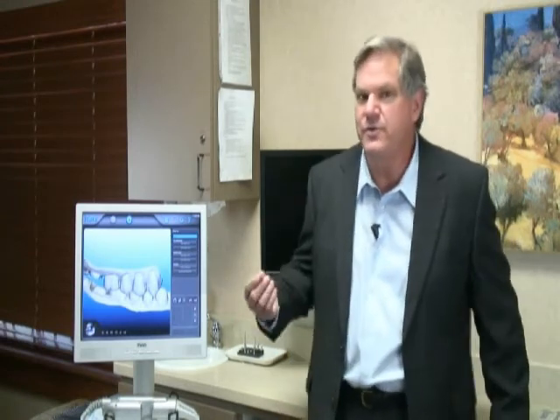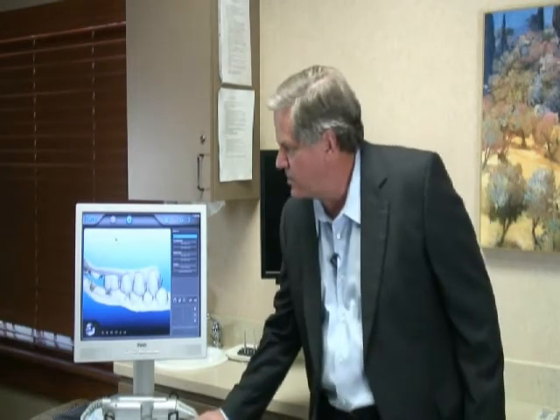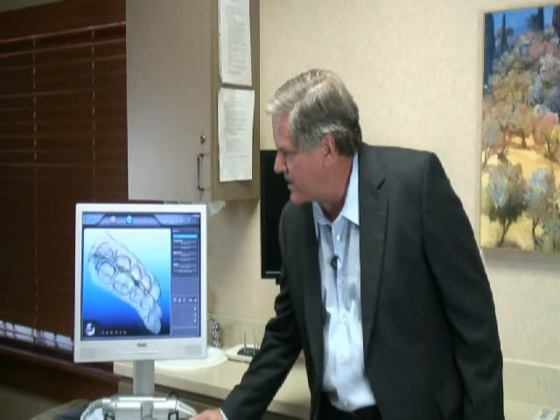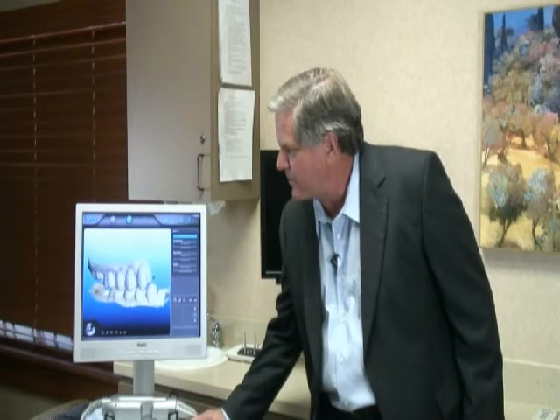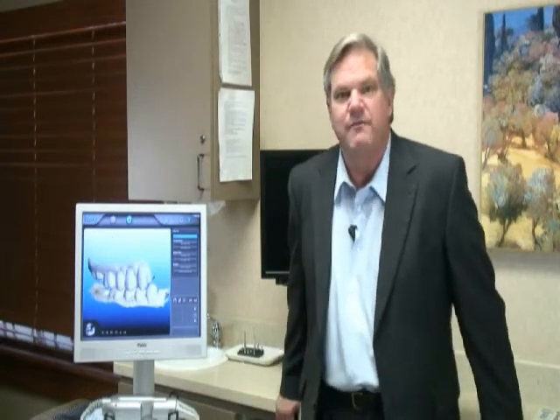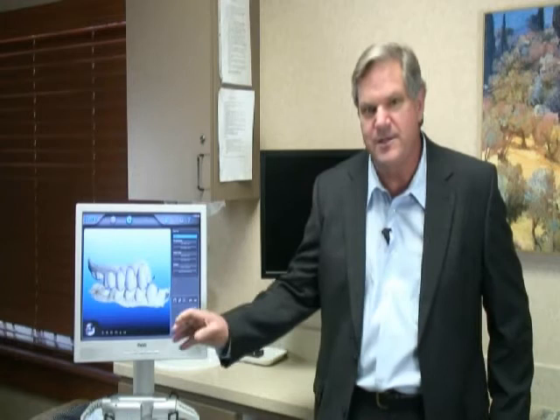Also at the first visit, gaggers don't have to worry about having that material in their mouth for five minutes. In fact, we can snap a picture as quick as a picture can be taken. You can take a rest, take another picture. A whole series of pictures are taken to generate what you see here — this digitized model. Also, if there's an area that we don't like on the impression, we can go back and simply use the erasing tool and erase that section and re-scan it right there on the spot.